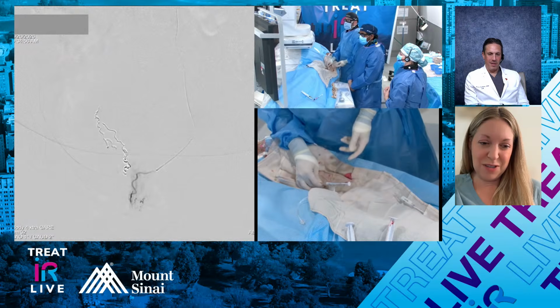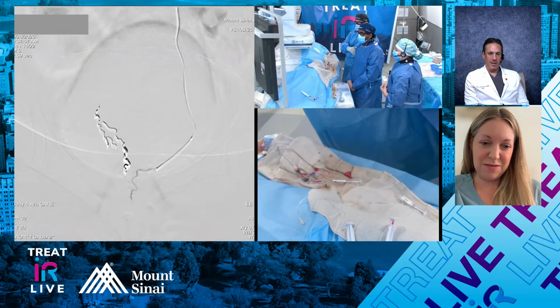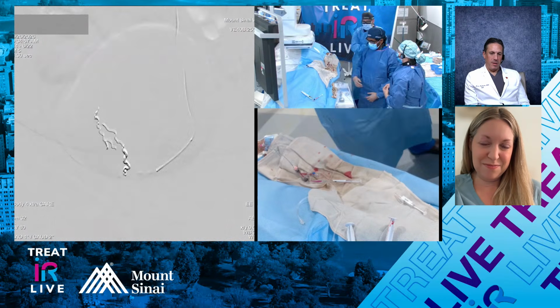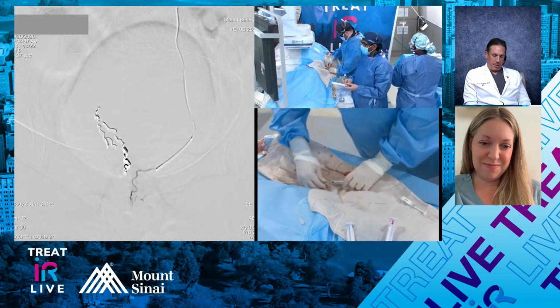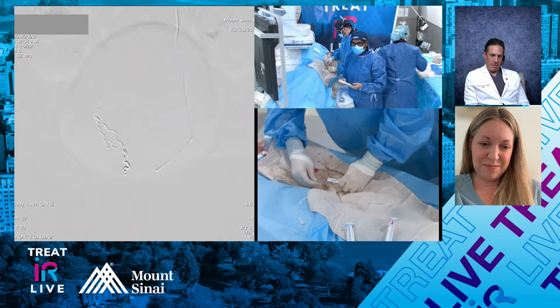That's great. It's a great angio too, because we're seeing that middle rectal blush come in at the end. Just perfect. That's a tiny supply right there. Cool. So again, we'll go back to our particles. This one we'll probably do a cc just because we are seeing some compensatory flow from the middle.